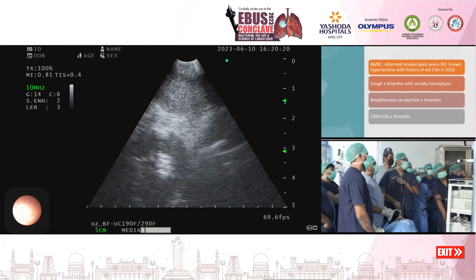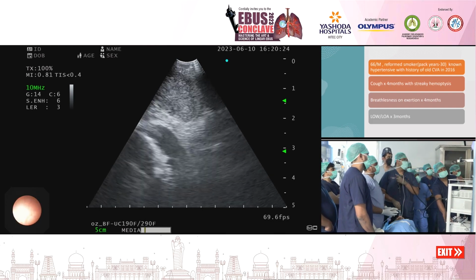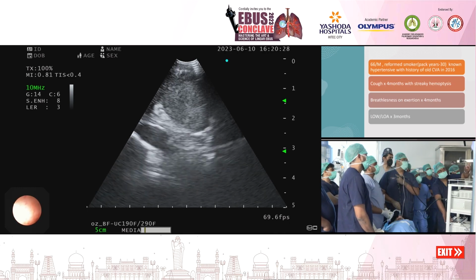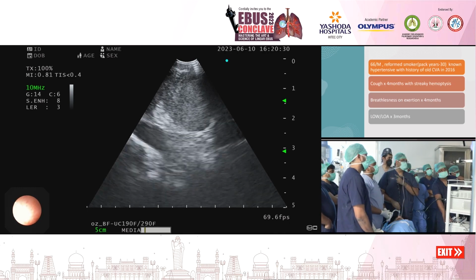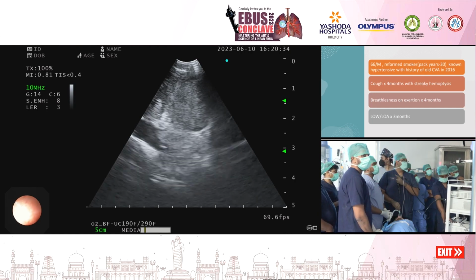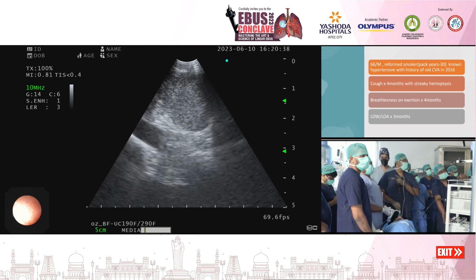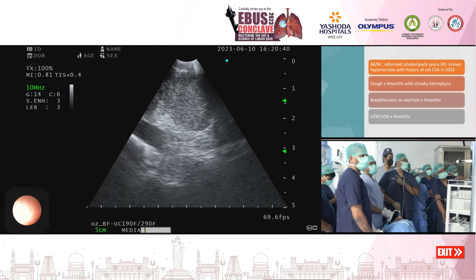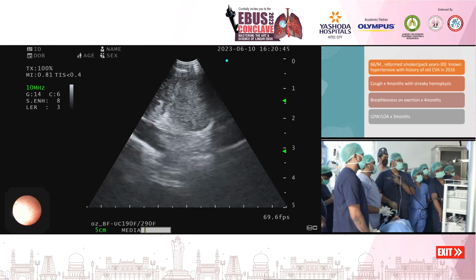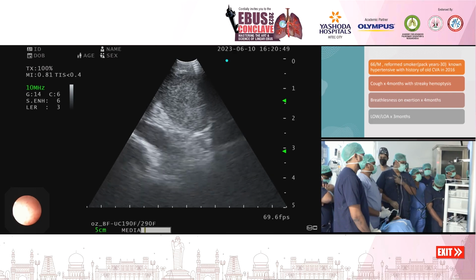Correct, Pradeep? Yes, sir. So it is not very clear. If you increase the structure enhancement, the structures will become more well delineated, more well defined. So you can see from 1 to 8 if you go, the rim becomes more clear. But actually an ill-defined node will become well defined, I would say. And then there are two modes, sir, in this, LER. First we will show the THEP and THER modes.